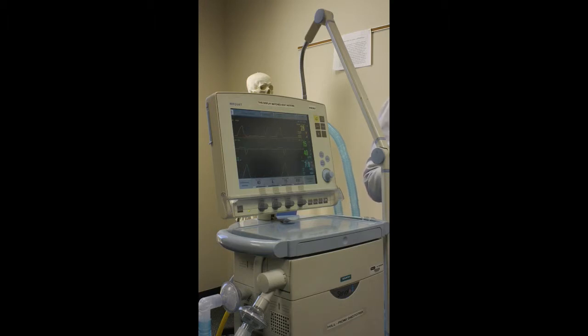PC stands for pressure control. So if we're in pressure control or PRVC, our max pressure will be listed here. So if we're in PC of 20, that would have a 20. If you're in volume control, it's an NA if you can, or a line through it. If you're computer charting, you just move on. PS stands for pressure support.